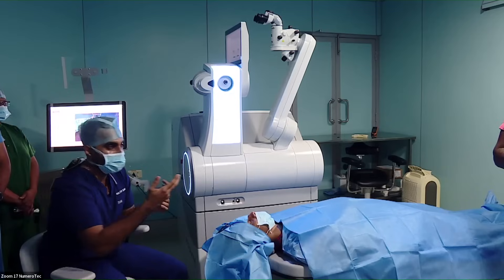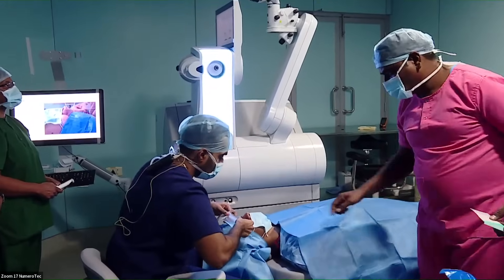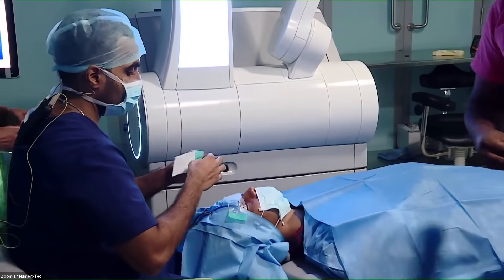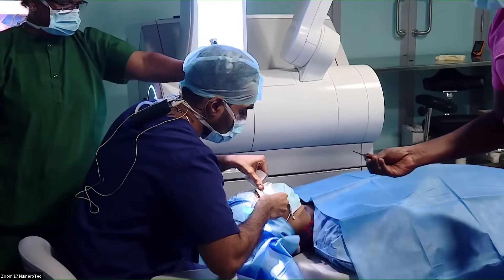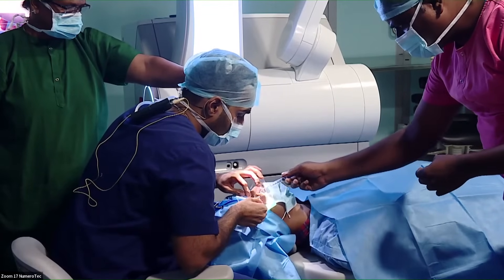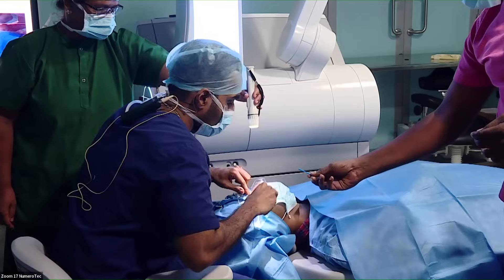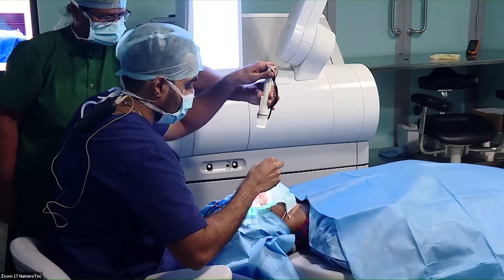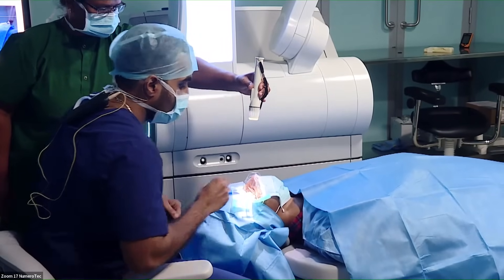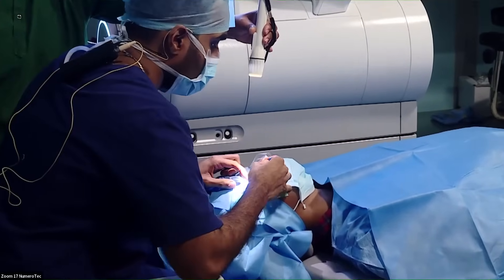Without further ado, let's go on with the procedure. I'm going to prepare my patient now. This step is very important — I'm drying the ocular surface. The idea is to keep the conjunctiva absolutely dry, while the cornea has to remain evenly wet for the laser to apply smoothly over an even area.